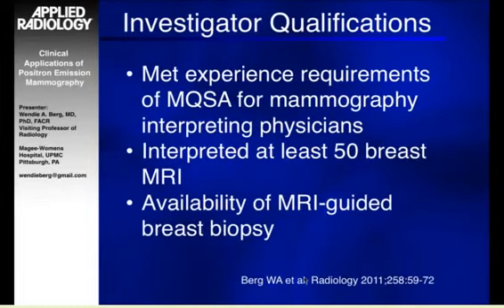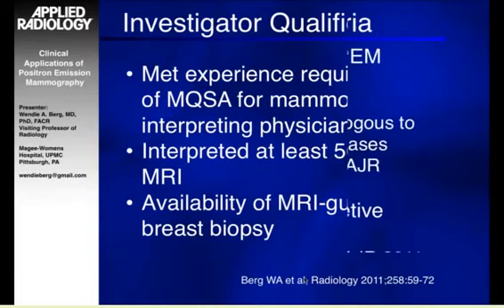We also tightly controlled the interpretive criteria as well as the qualifications for the investigators. So all of our physicians who interpreted PEM studies as well as MRI met all experience requirements of the Mammography Quality Standards Act for mammography interpreting physicians. They also had experience interpreting at least 50 breast MRI examinations, and all facilities had to have availability of MRI-guided breast biopsy.